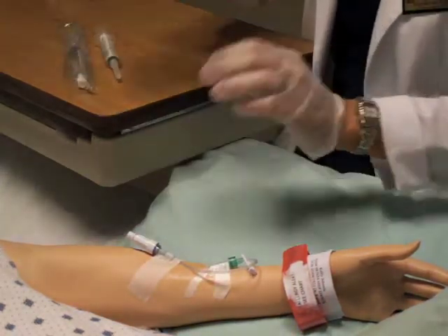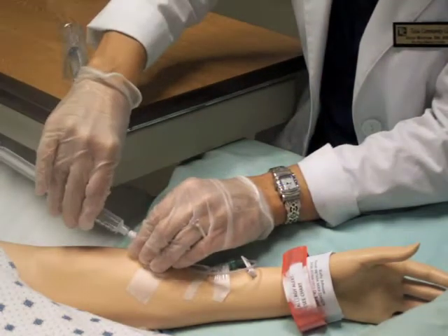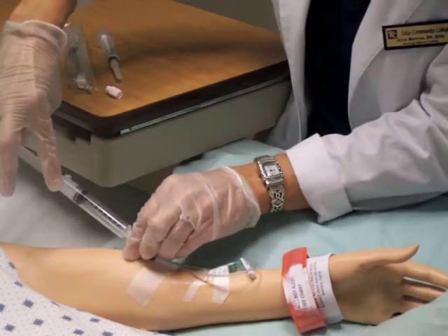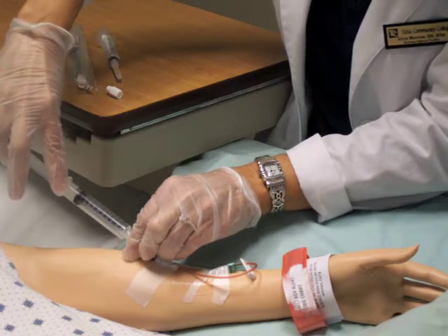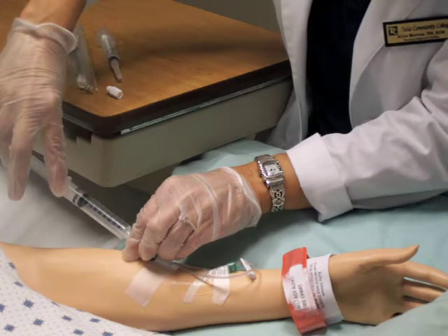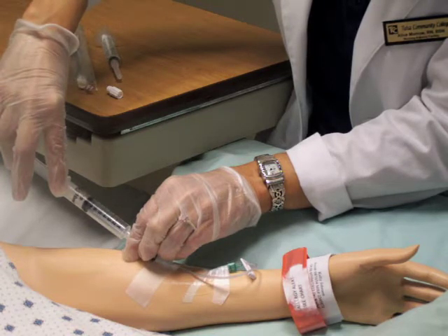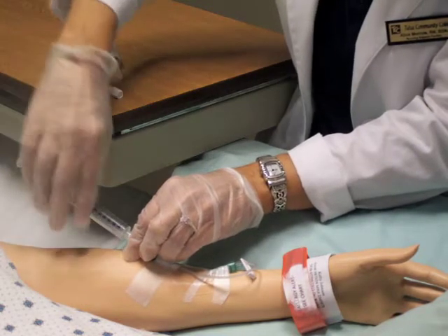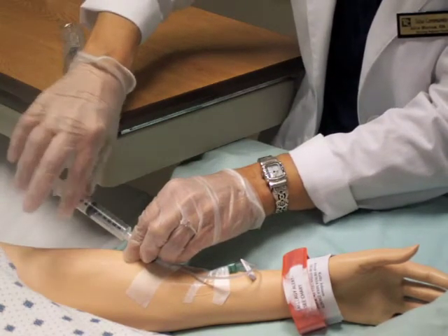Insert the saline flush syringe and pull back on the plunger of the syringe in order to aspirate a small amount of blood. This confirms that the port or IV site is patent. Flush the IV access device with the appropriate amount of saline, 1 ml every 5 seconds, 3 to 5 ml for peripheral, or 5 to 10 ml for central line, using the push-pause method. This method creates turbulence and maintains patency of the IV catheter when fluids are not infusing through the catheter.